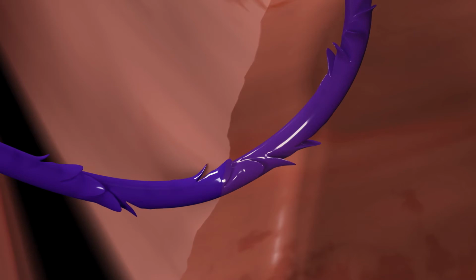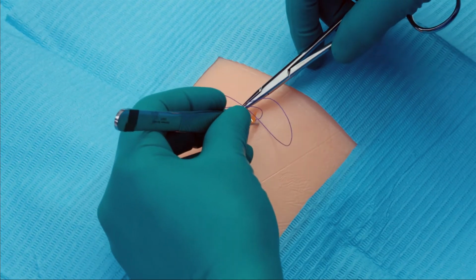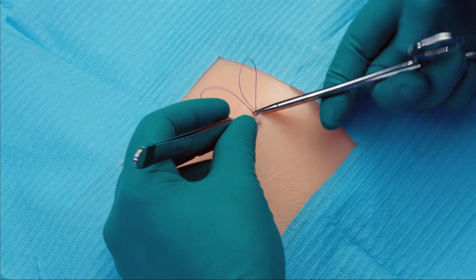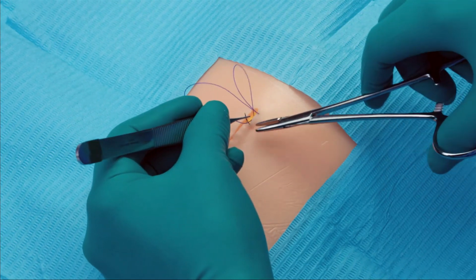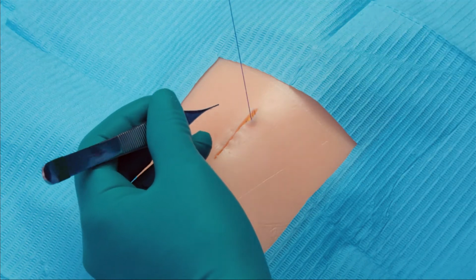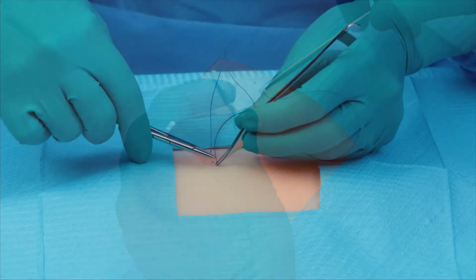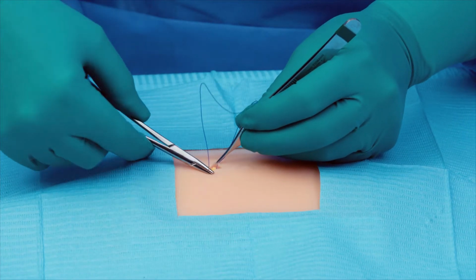secure fixation. We then proceed with the closure of the deep dermis by running the Quill device in a simple, continuous fashion. And some people like to make most of these sutures loose in the beginning and then pull them tight. I like to tighten them each time.